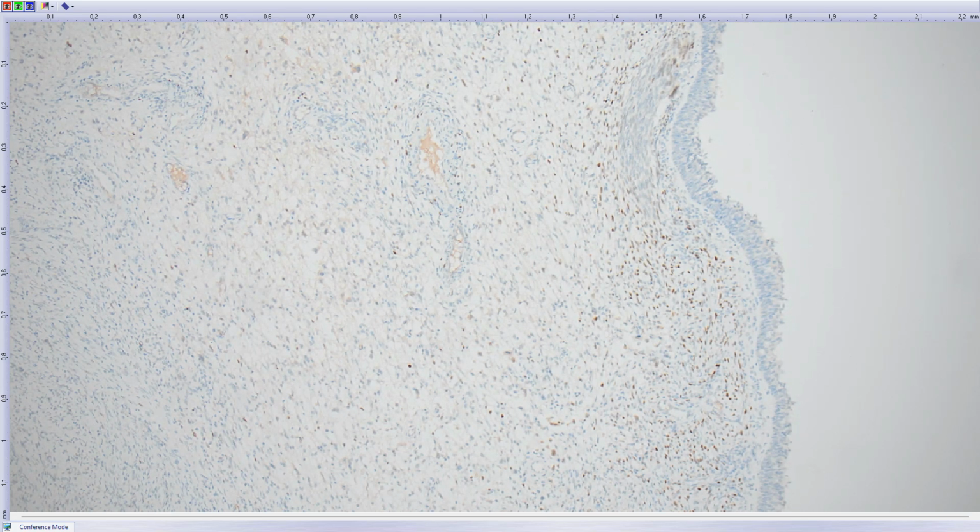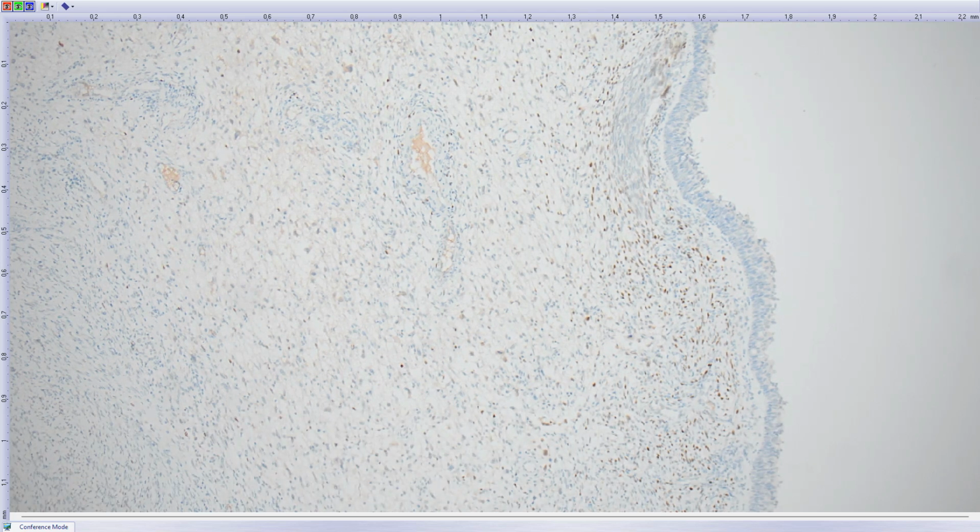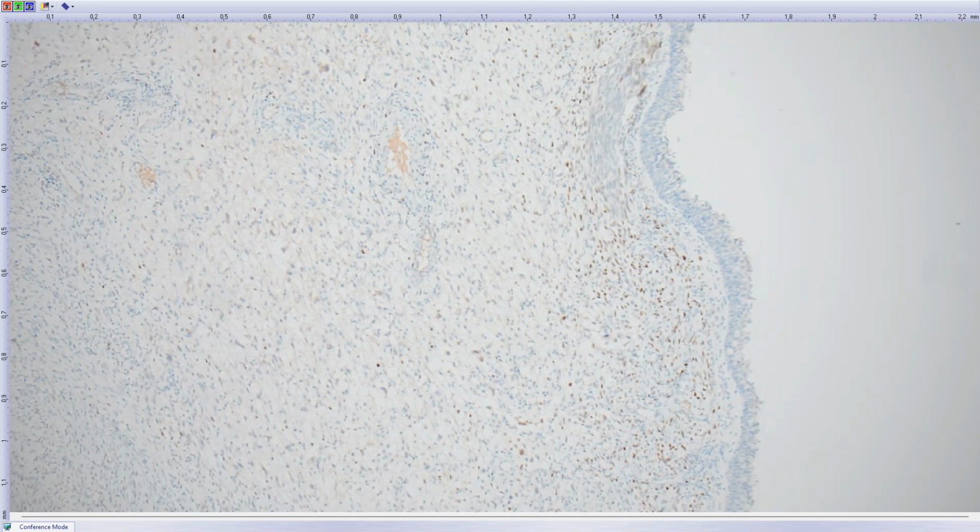So we've got S100 and myogenic markers, and the tumor must be biphenotypic sinonasal sarcoma. Great. You have a fusion? Yeah, and I've got the classical fusion involving PAX3 and MAML3 genes, so this is the most common situation.